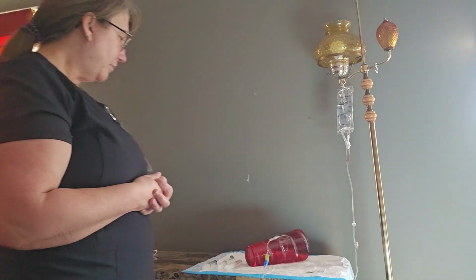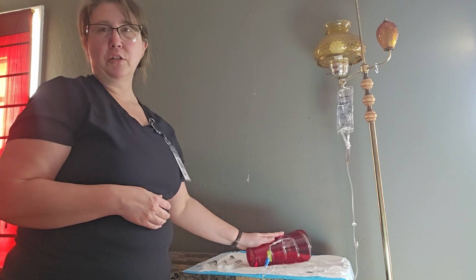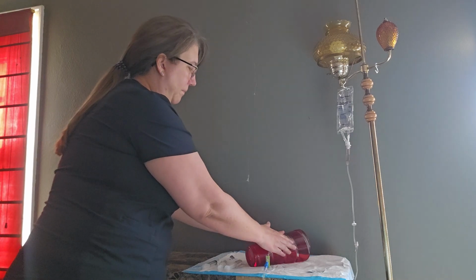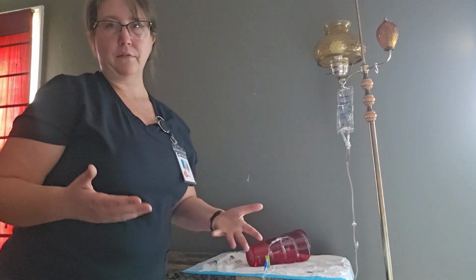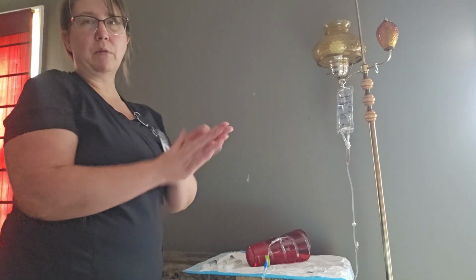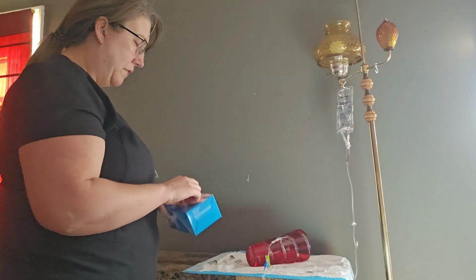For video purposes, this is going to be the arm of the patient, and I already have everything ready to demonstrate how to give a medication push into a patient. Next, I will do my hand hygiene again, and I will put on gloves.